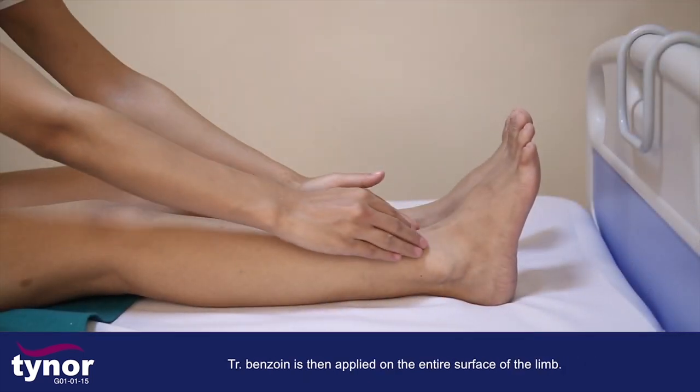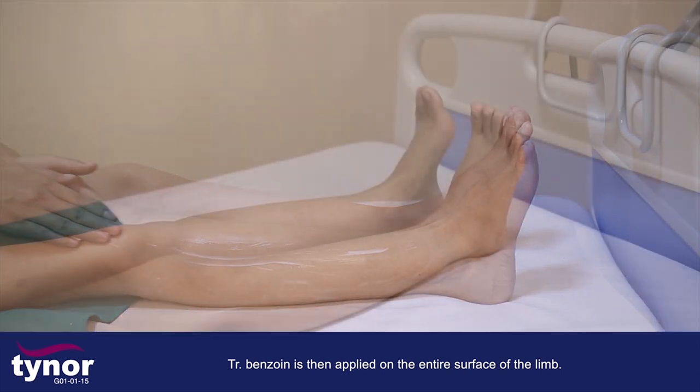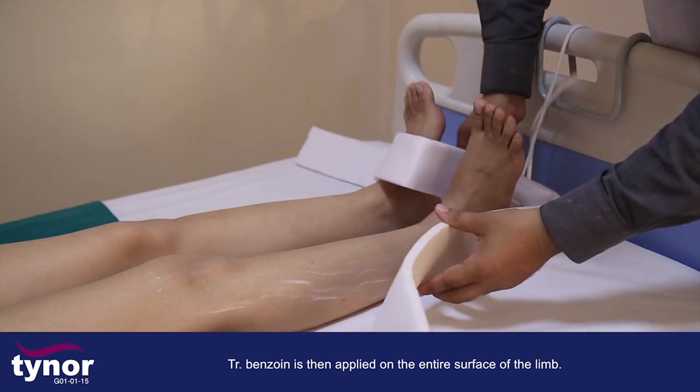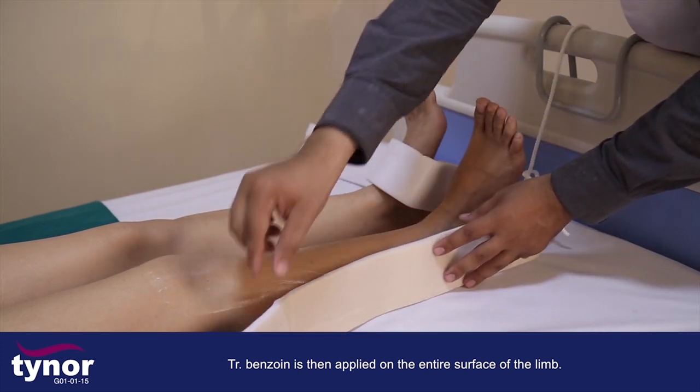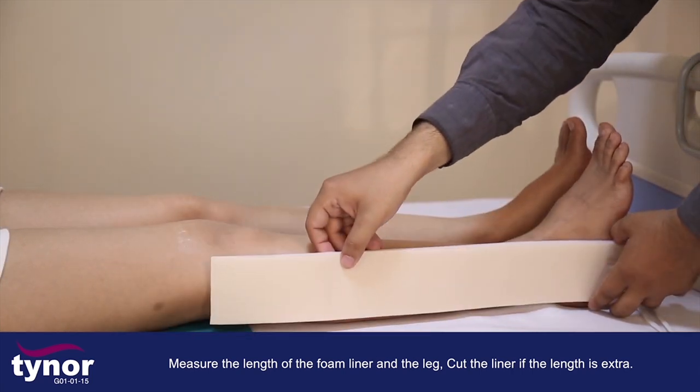Tincture benzoin is then applied on the entire surface of the limb. Measure the length of the foam liner against the leg and cut the liner if the length is extra.